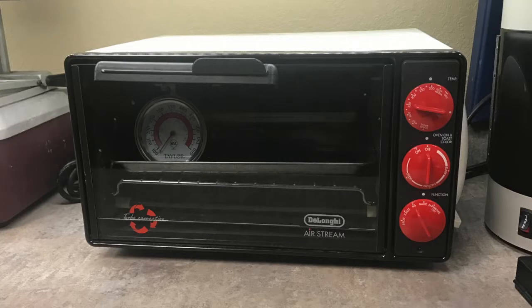Once the initial polymerization has been accomplished, the onlay is removed from the silicone die, which is easy to do because it is flexible. The onlay is placed into any $20 toaster oven from Walmart to complete the curing process. The time and temperature settings need to be 250 degrees for 7 minutes. The oven needs to be preheated and the temperature monitored with an accurate oven thermometer.